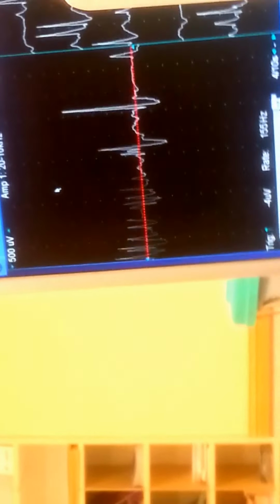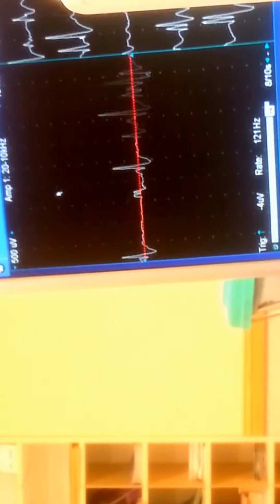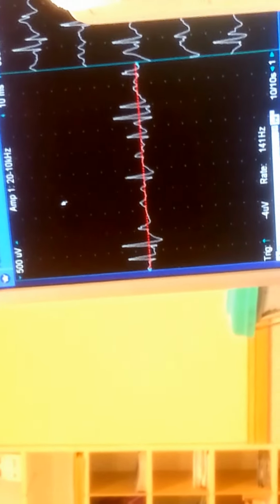Okay. Gently raise your thumb right to there. Push up. Okay, this is normal. Nice and skinny and a steady increase. Breathe easy.